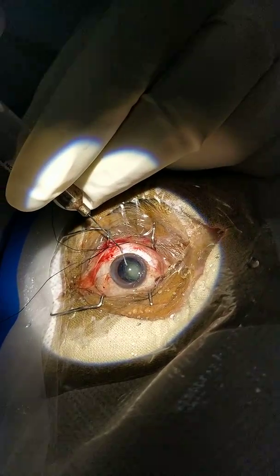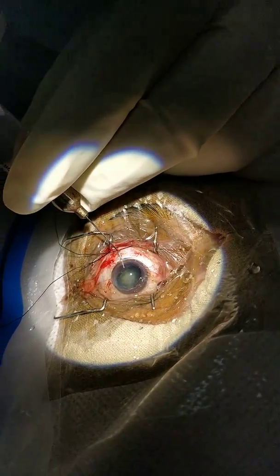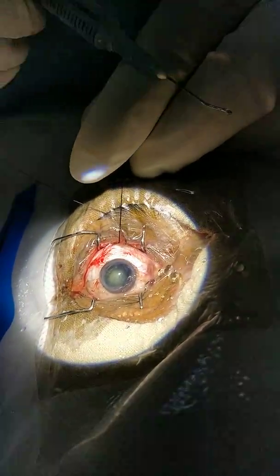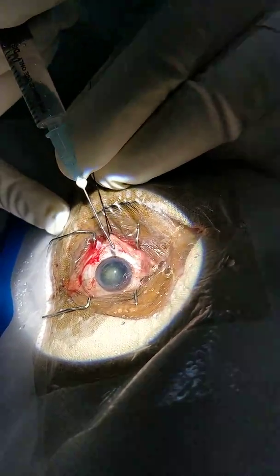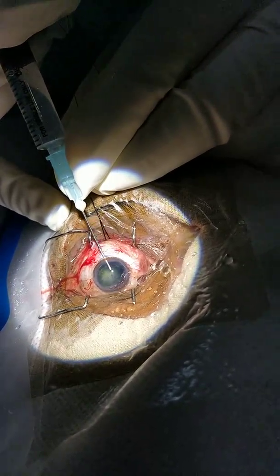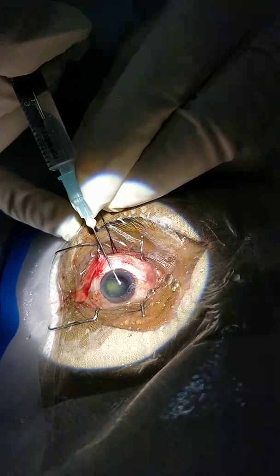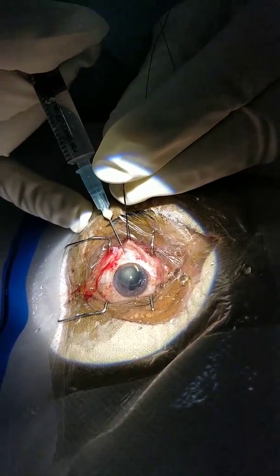You can see that because of the good hydrodissection, the nucleus has already prolapsed into the anterior chamber. Now I will do viscoexpression of the nucleus and deliver it out.